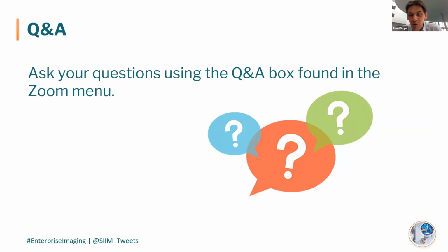Then a very important question on whether pathologists will need to sit in a special reading room. I explained in the Q&A that in the past this was the case for radiologists, mostly because a long time ago the first medical displays were quite dim. Because they were so dim, the only way to perceive all the image details was to sit in a darkened environment. Modern medical display systems are high brightness, and you can read in normal or almost normal office conditions.